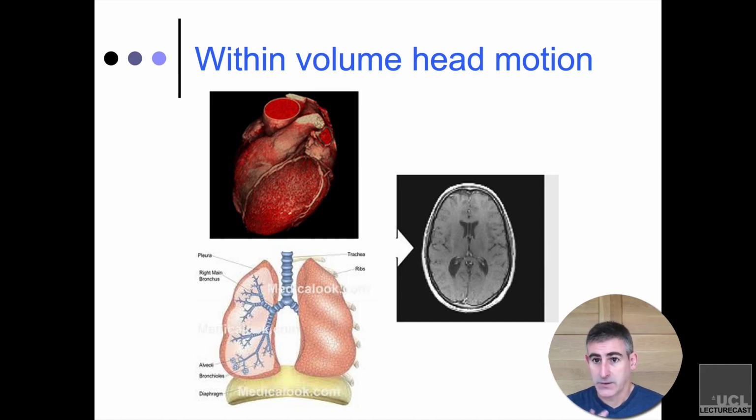So like along the brainstem where the basilar arteries are strong and receiving very direct high pressure blood from the heart, you actually get quite a bit of movement. Whereas on the outer edges of the neocortex, you get less. This is all things that are not being corrected by realignment. It's affecting the realignment, but it's doing it at such a rate that we don't have enough data, again, to sort of tell you how to deal with it.